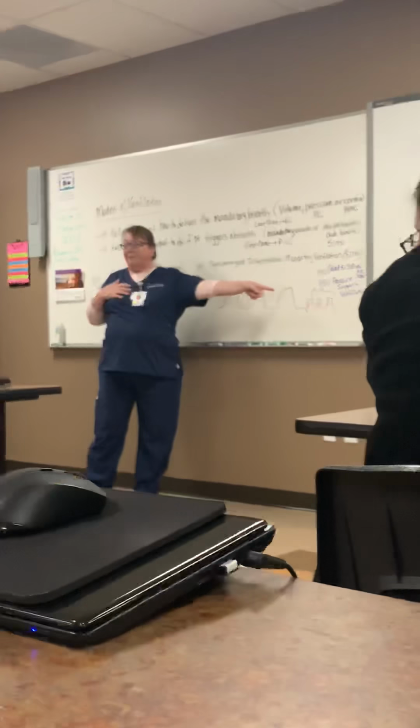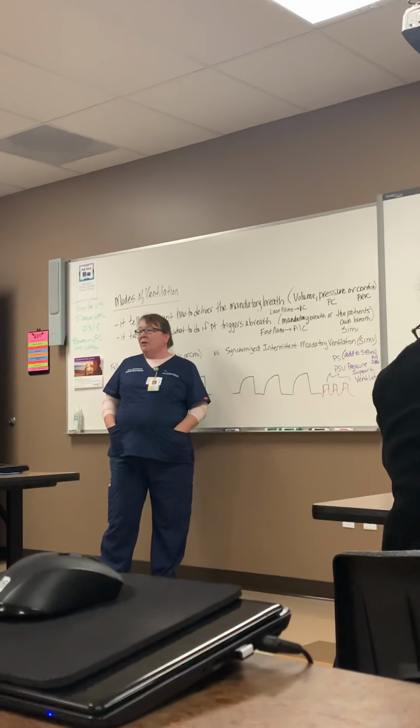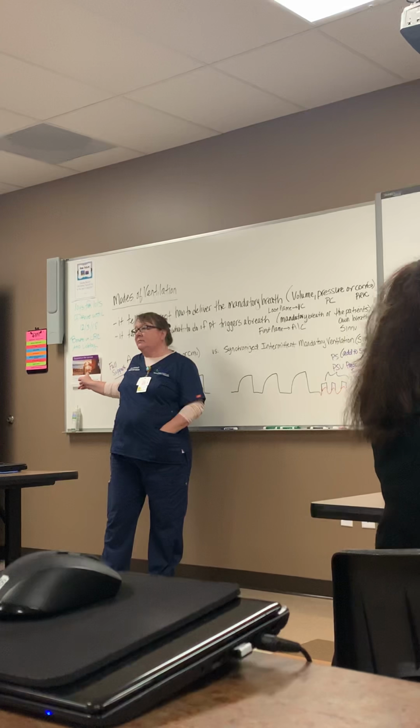A pressure support option. You should see that when you're on your ventilators. So if you're in AC, there is no pressure support option. That's probably where I'm confused.